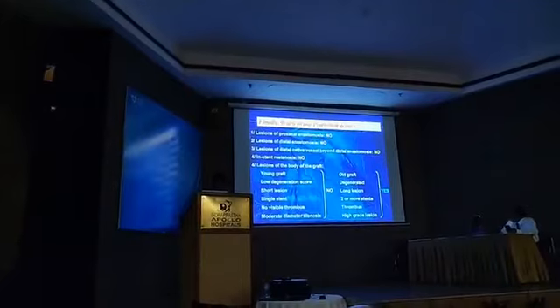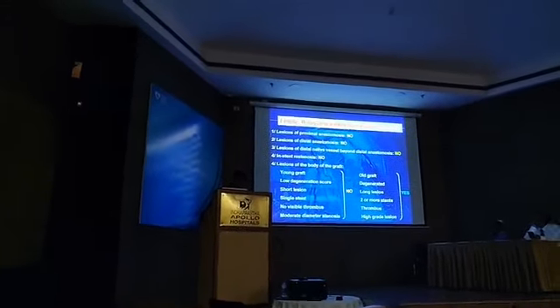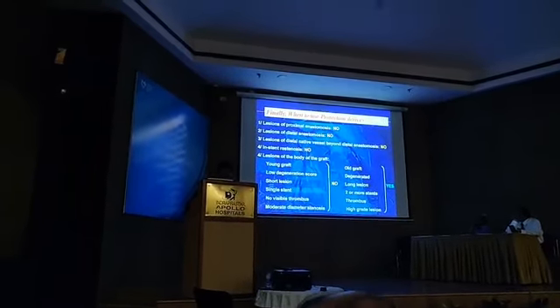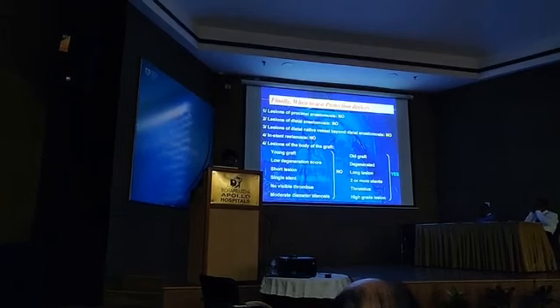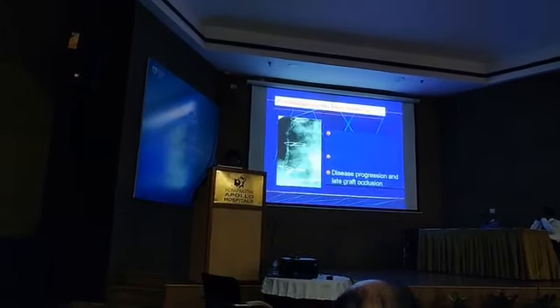distal protection devices. Finally, when to use protection devices: old graft, degenerated graft, long lesion, two or more stents, thrombus, very important. The high grade lesion, then of course you have to use it. And in many cases, when you have a young graft, low degeneration, short lesion, single stent, no visible thrombus, then don't use this. So there are limited indications, but they are required in more than 50% of saphenous vein graft angioplasty.